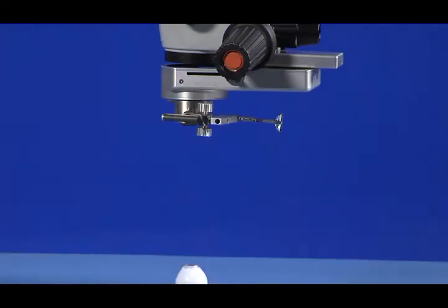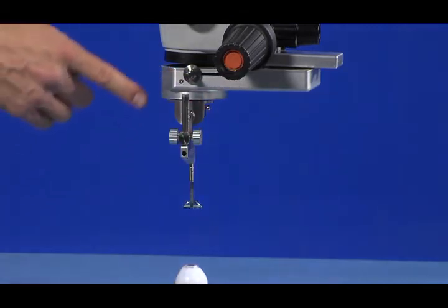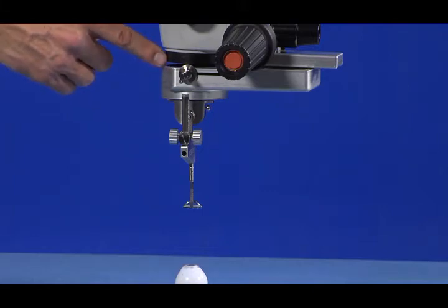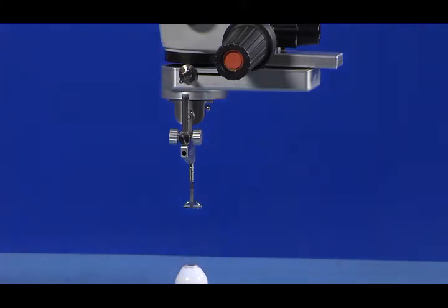Step 3 is to switch the LPU to its down position. Additionally, confirm that the CLA condensing lens is in its forward position beneath the microscope objective lens. For the automated CLA, this should happen automatically. For the manual CLA, the user will need to pull the lens forward using the sterile handle. Also make sure that your endoillumination source is on and illuminating the retina.